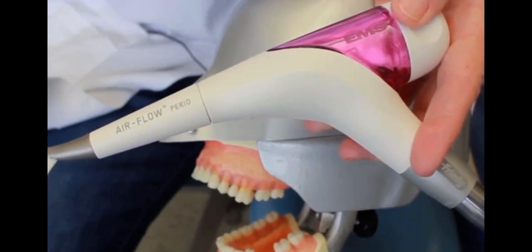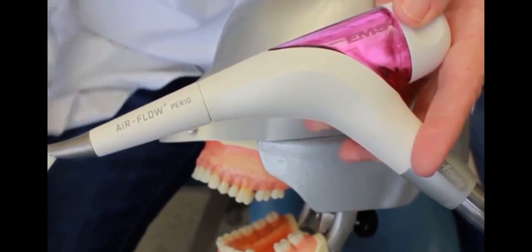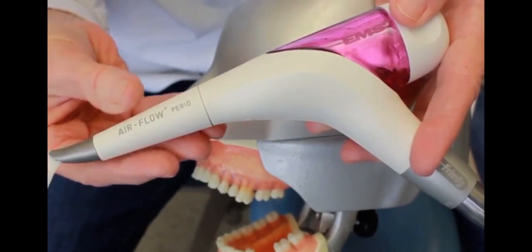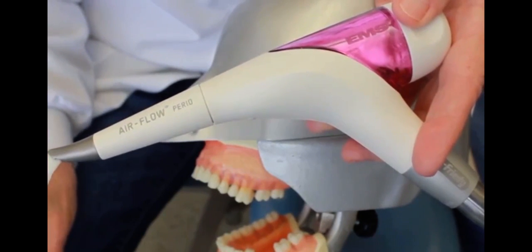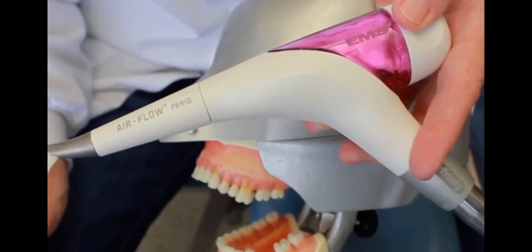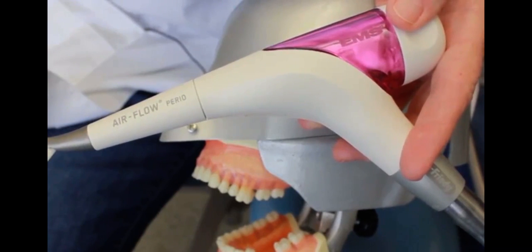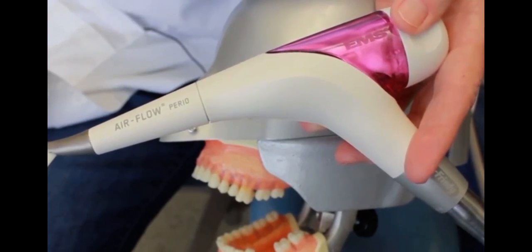In the past few years, we found that using a subgingival air polisher with a glycine powder — which has a very small particle, smooth and round — it is 80% less abrasive than the sodium bicarbonate, so we can use that subgingivally. Glycine powders are approximately 80% less abrasive than the sodium bicarbonate.